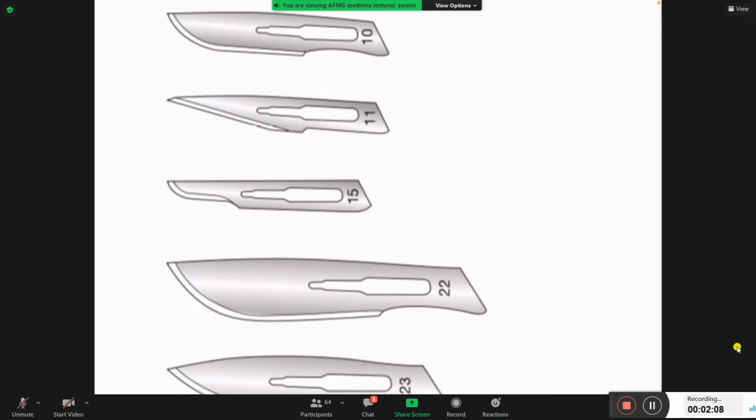So say for example, if you have to drain an abscess, the abscess as a cavity, we give a stab incision on that and let the pus come out. So this stab knife is primarily used for a cavity. If you are asked to do arteriotomy, what is arteriotomy?